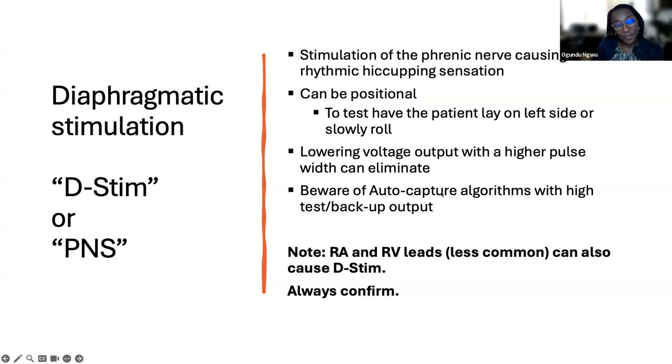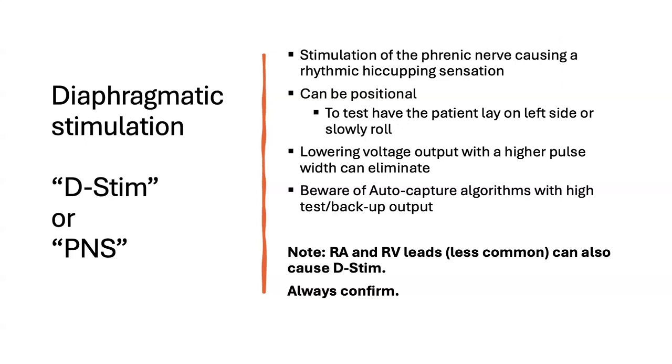Next slide. Yeah, one thing I would say when you're actually testing, you may have it where the lead is pulled and moved around or for whatever reason, when you go to test in clinic, you may not just observe it at baseline sitting down, but having them lay on their left side or lean on their left side, having them roll if need be, or placing your hands on their abdomen and feeling whether or not you actually feel that rhythmic hiccuping. Generally, you can actually feel it yourself as well, which is a good way to test. That way you don't send the patient home thinking that it's all in their head, and then they continue to have it at night when they go to sleep and lay on their left side.